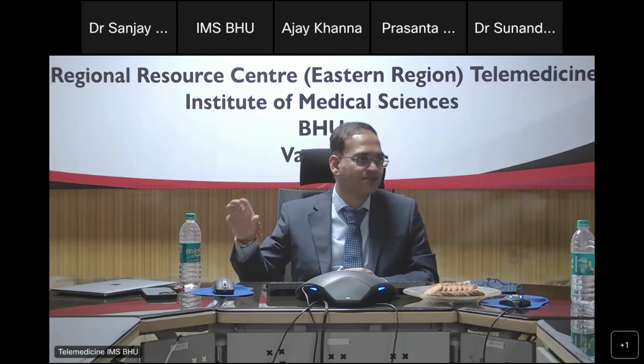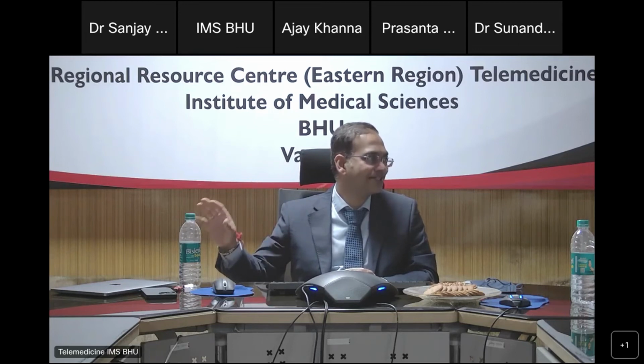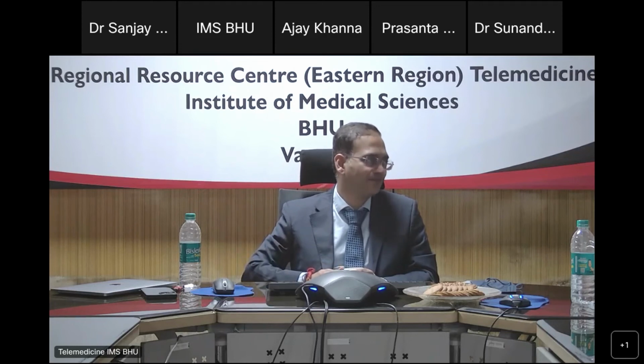Neuroradiology, musculoskeletal, everybody has their own patients lined up already. So mainly workflow and logistical considerations. If you were given a dedicated cardiac MR for your cardiac cases, what would you think, that it would be 50-50? Yeah, I think then it will be 50-50. So it's not basically technical considerations, it's more logistical reasons. Yes.